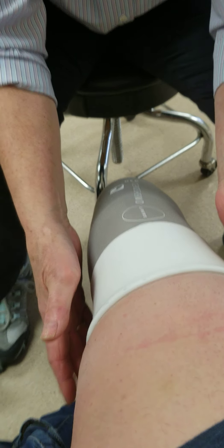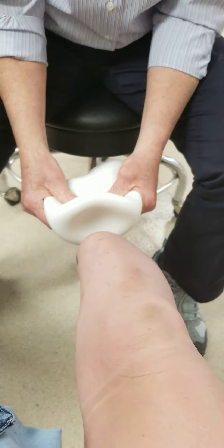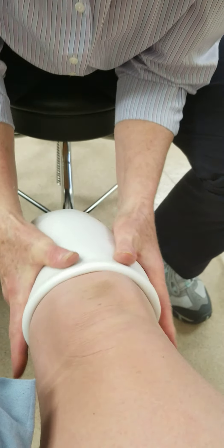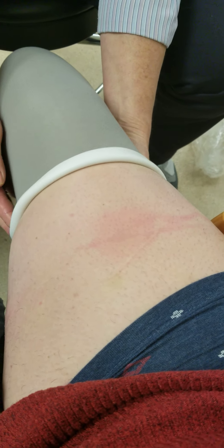Maybe I will go cut it so I won't have double thickness. Going on easier now — still a little slippery but not as bad.